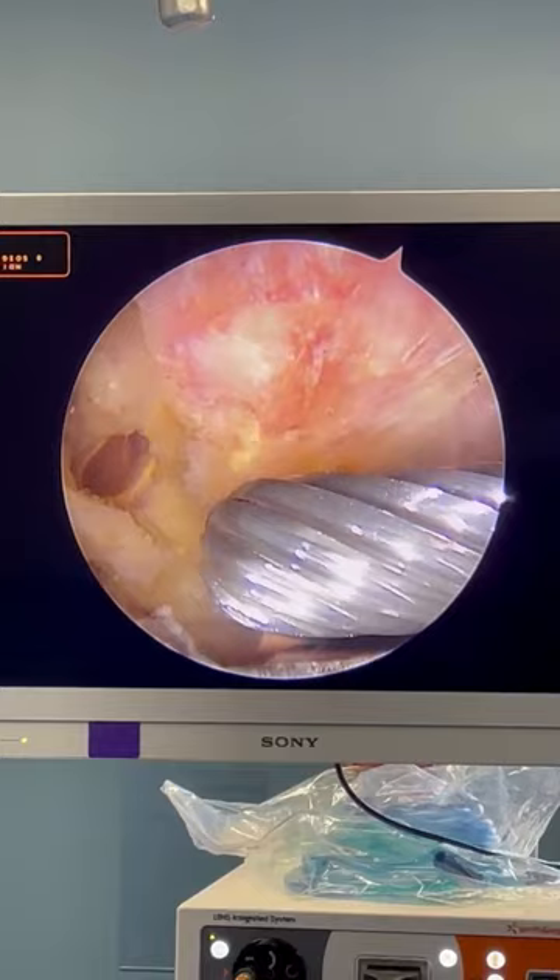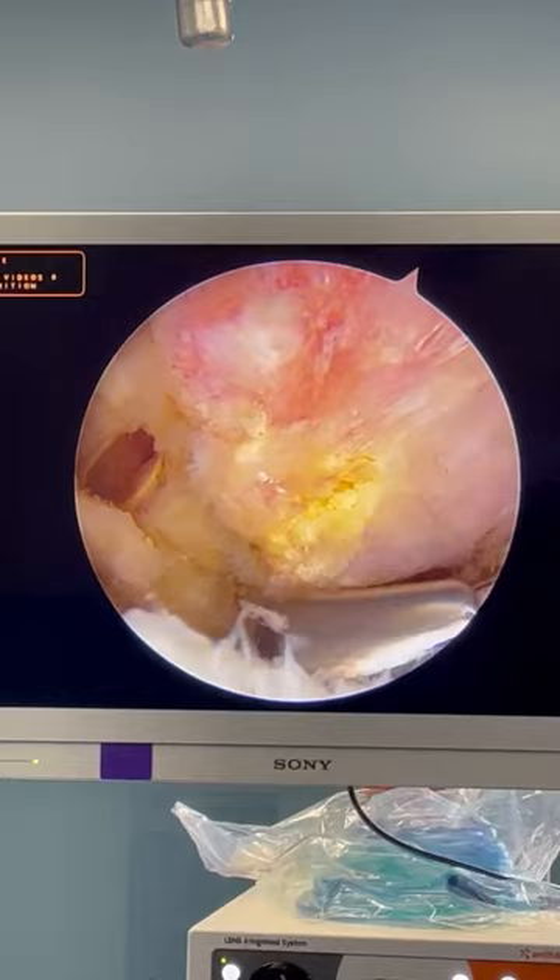This is a device like a burr that we use to remove bone and bone spurs, and here it is removing this patient's bone spur.